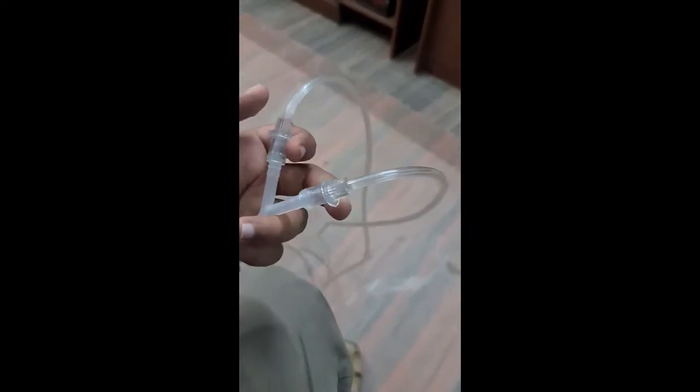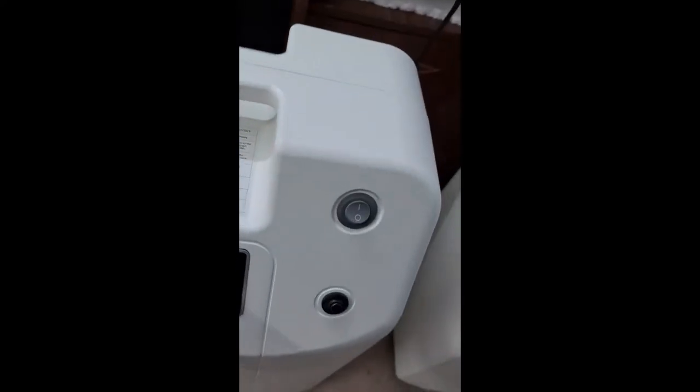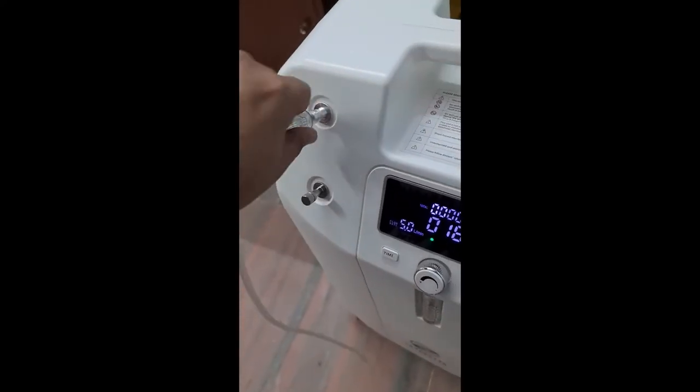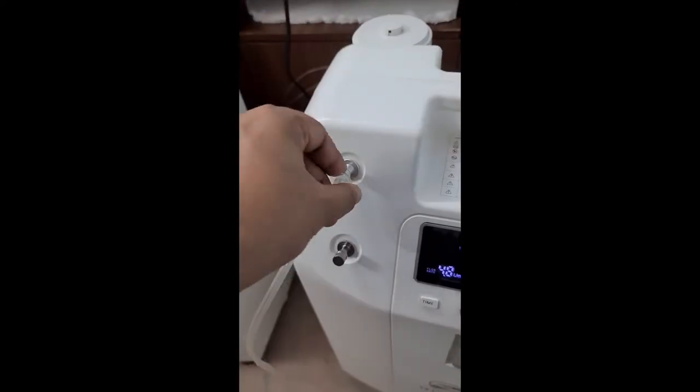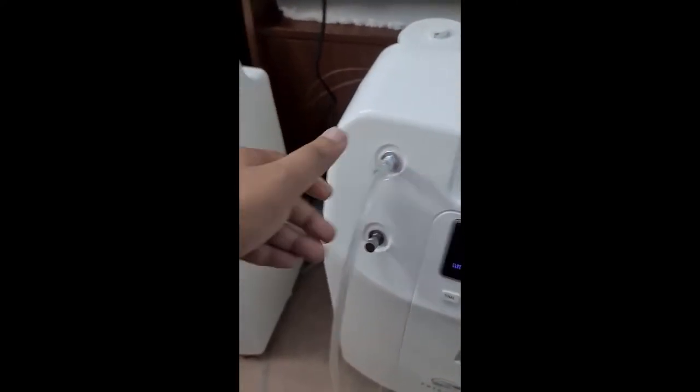What we are doing is attaching 2 oxygen outputs to the Y-interface, and finally from this interface we attach the cannula — so there are going to be no leaks. This end we take and connect to one machine, and the other end of the Y to the second machine. We have connected the cannula, and the 10 LPM flow will come through this pipe.